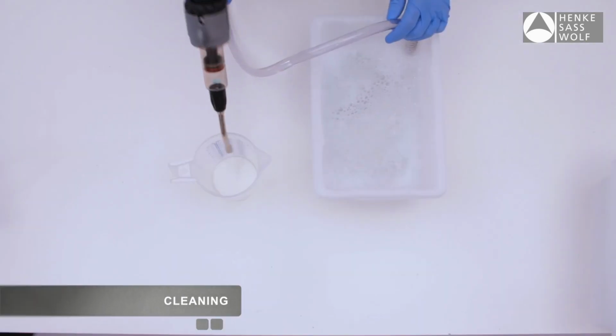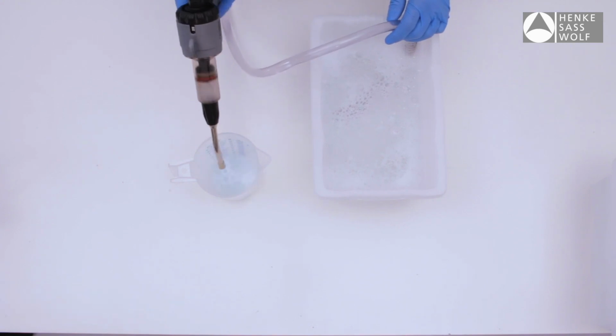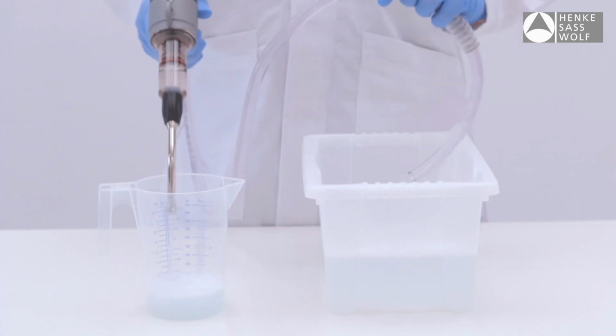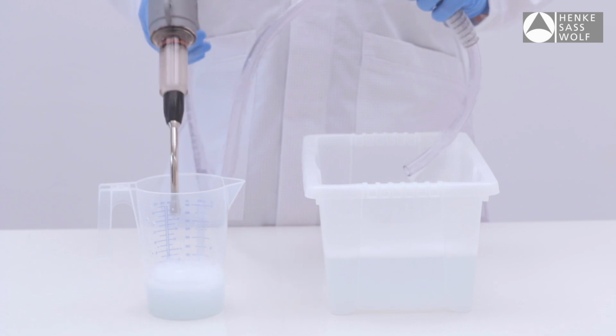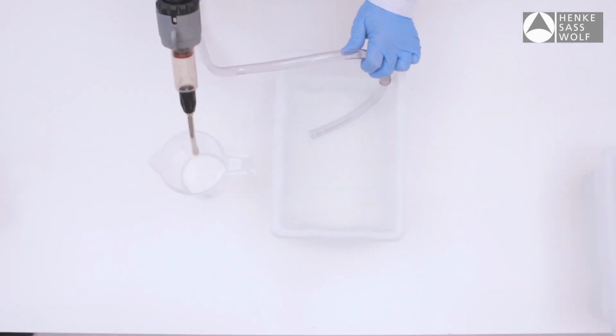Remove all traces of material from the syringe by flushing thoroughly with a hot water detergent mix. Rinse thoroughly with clean, warm water.